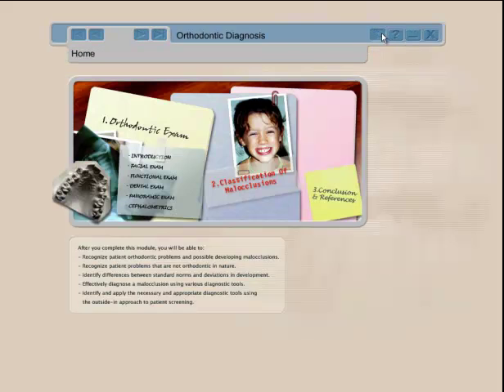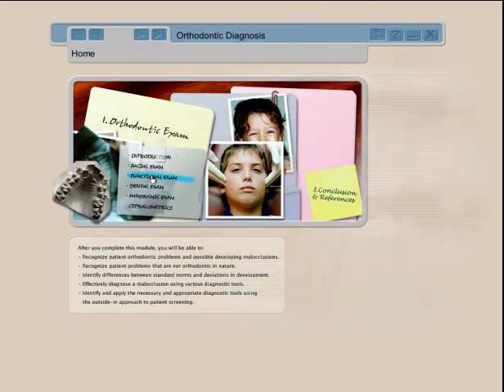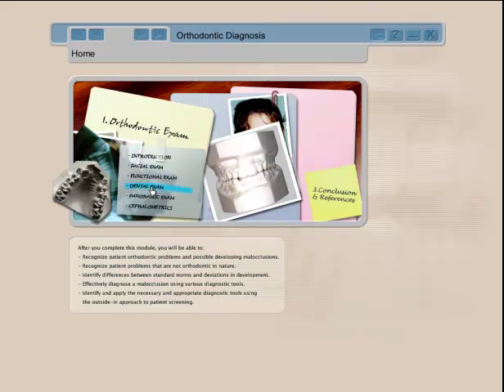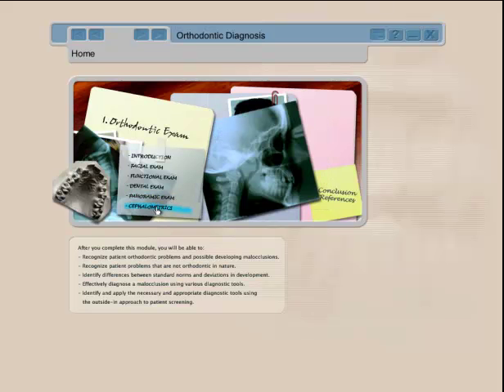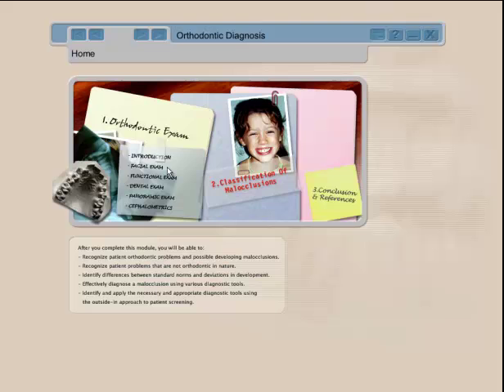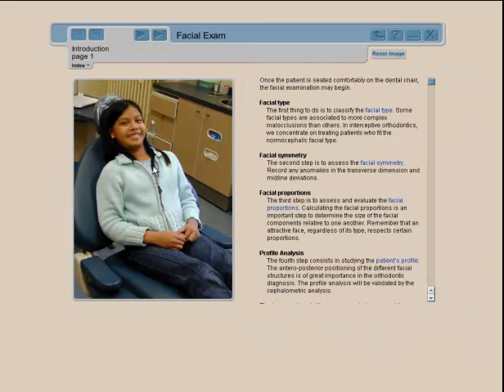The CD is divided into different sections: this one is the facial exam, this one is a functional exam, you have the dental exam which is the intraoral and dental cast analysis, we look at panoramic examinations, and then we have a fairly in-depth cephalometric analysis for general practitioners.